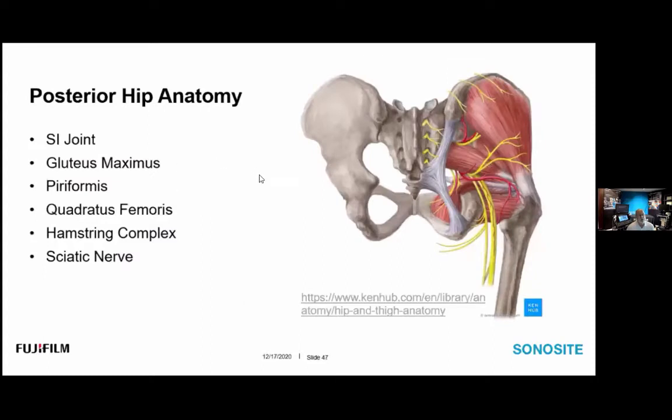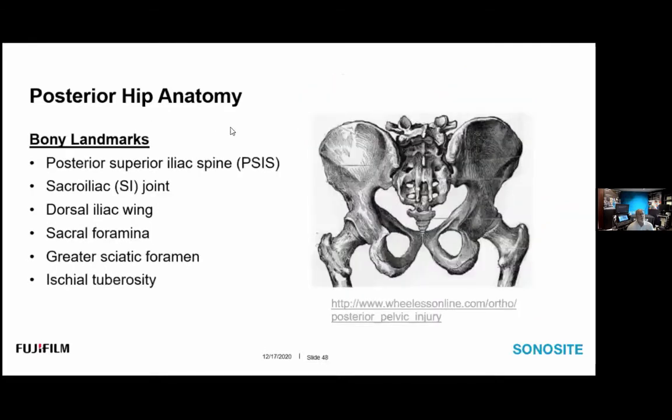The anatomy covered today includes the SI joint, gluteus maximus, piriformis, quadratus femoris, the hamstring complex, and the sciatic nerve. Bony acoustic landmarks — always our starting point — include the posterior superior iliac spine, the sacroiliac joint, the dorsal iliac wing, the sacral foramina, the greater sciatic foramen, and the ischial tuberosity.